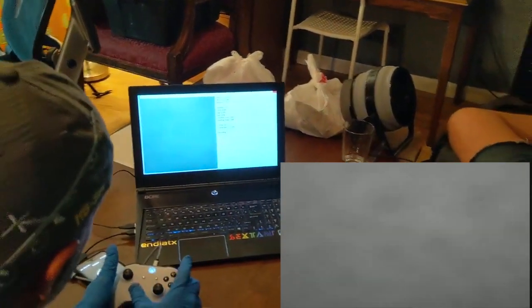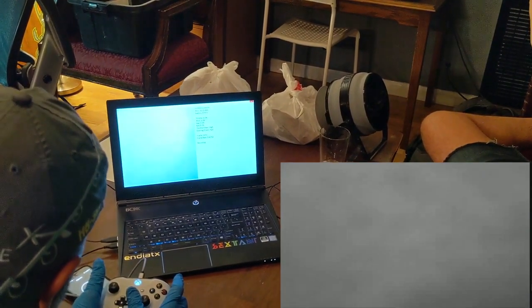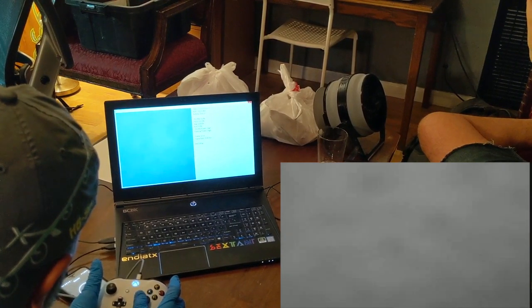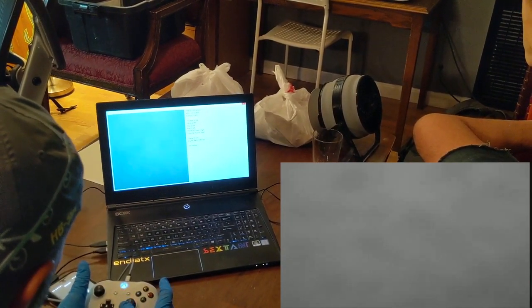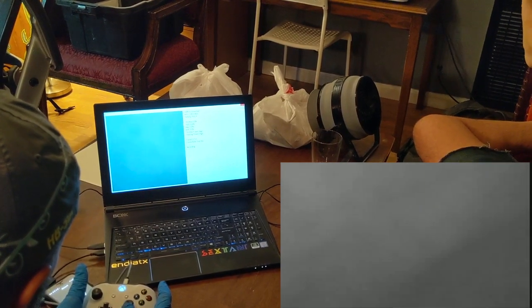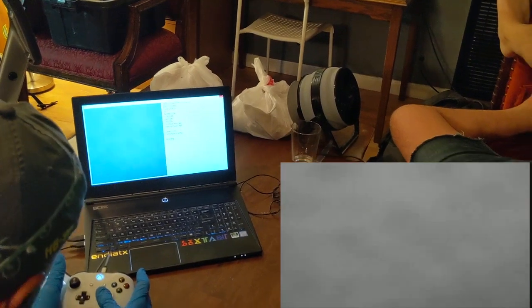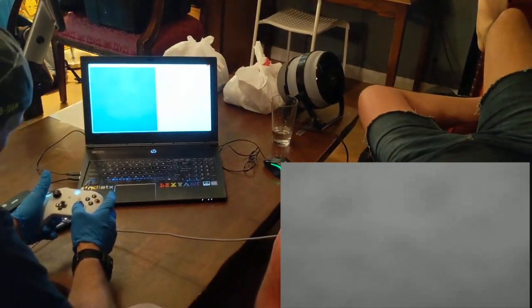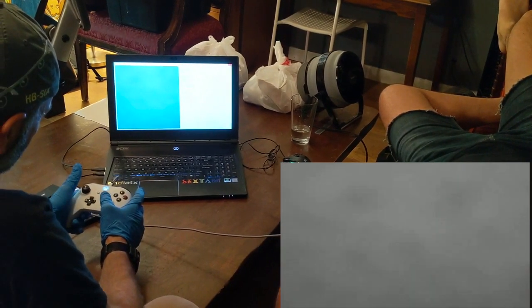I was kind of over to the right. I'm going to cut a little bit to the right now. A little bit more to the right. Just a slight movement. The speed's getting larger. I'm going to go forward a little. I'm going to try to look at that. Look at that. Is that like your esophagus maybe? I mean I guess you'd have a lot of folds in the surface area.